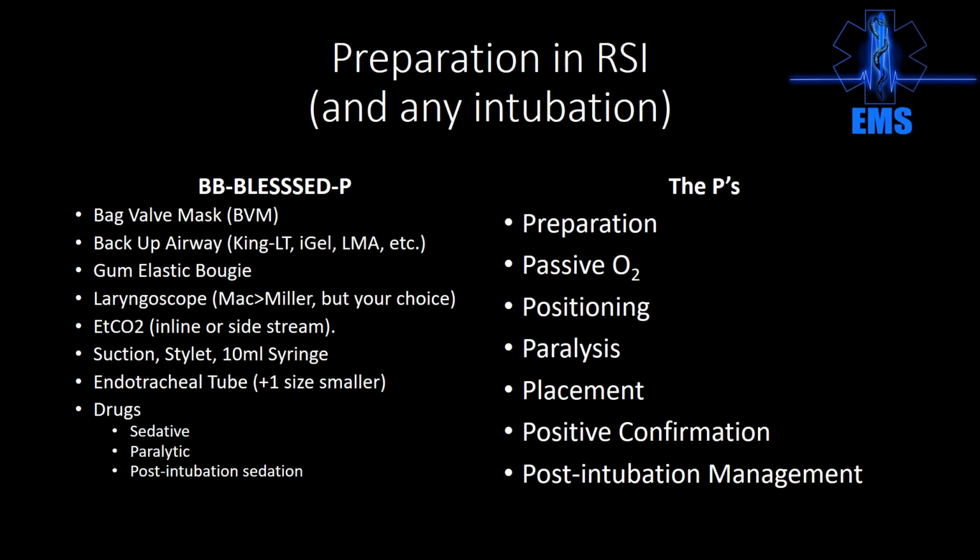Moving on to the right side of this slide, slide 7, the P's. So preparation. This is where BB Blessed P comes in. Getting all this stuff arranged and you're looking at it and prepared to use it is going to save you a lot of mental energy in actually completing this procedure.